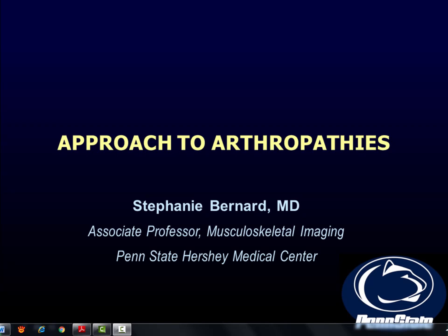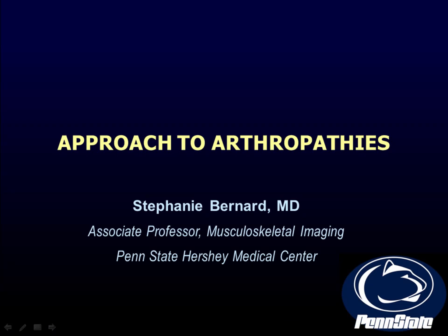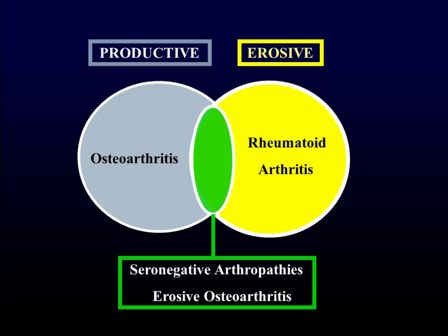My goal is to cover an approach to evaluating arthritis films and then to talk about specific entities where the arthropathy may present as either a sports medicine injury, a tumor, or infection. So when I'm approaching arthritis, I'm usually fitting them into one of three categories.